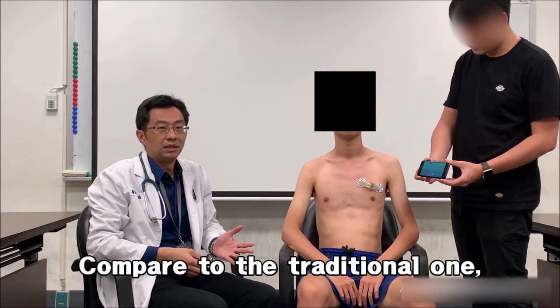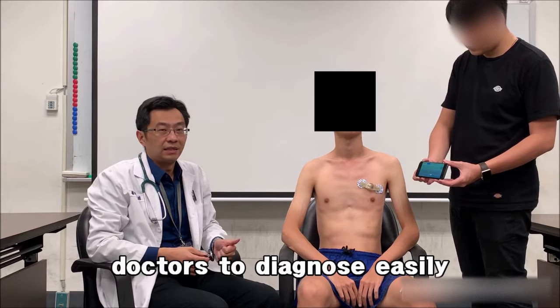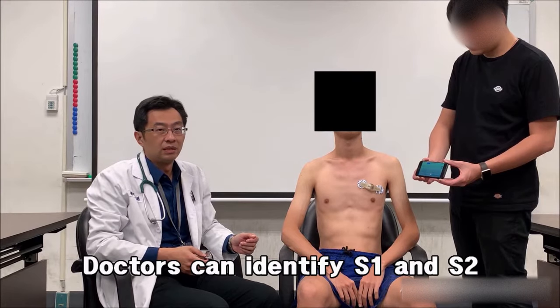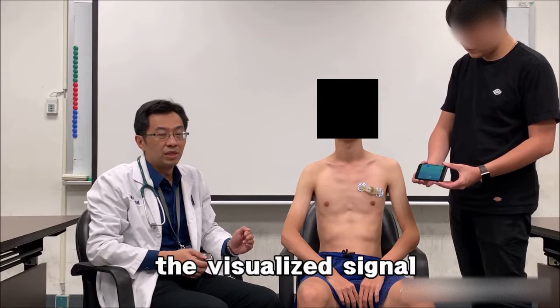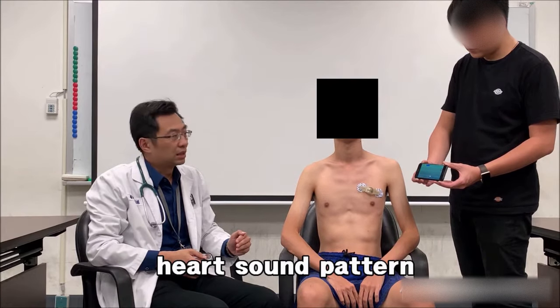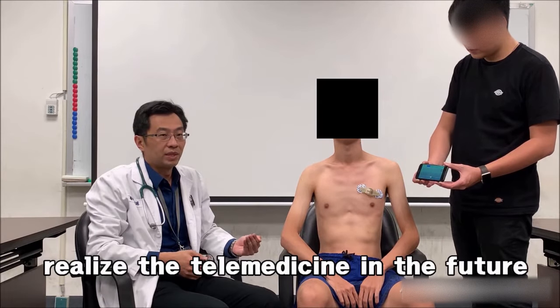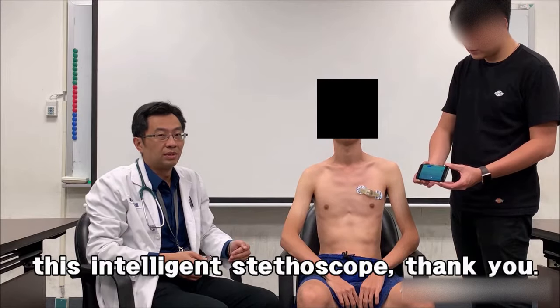Compared to the traditional one, this intelligent stethoscope can help doctors to diagnose easily. Due to the simultaneous ECG measurement, doctors can identify S1 and S2 more easily according to the visualized signal. It is expected to help doctors to diagnose, medical students to learn heart sound patterns, and even realize telemedicine in the future. The above is a simple demonstration of this intelligent stethoscope, thank you.